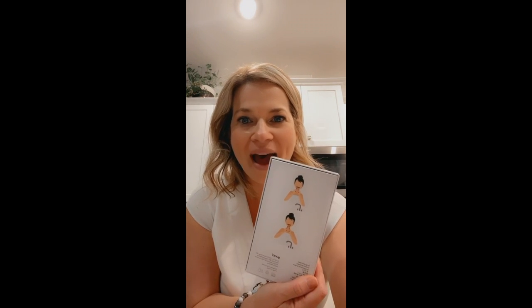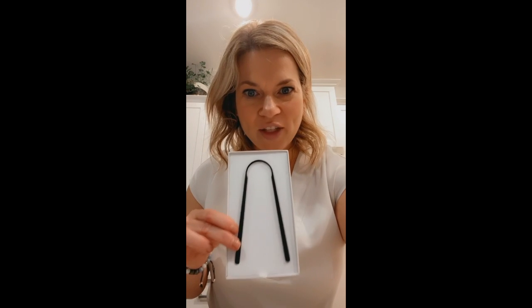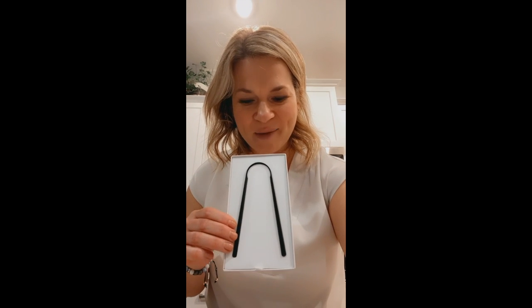I've just got my Gunky unpackaged here. It comes in this really nice box with some instructions on the back and we're gonna open it up. This is what it looks like inside and I'm just gonna lift it out.